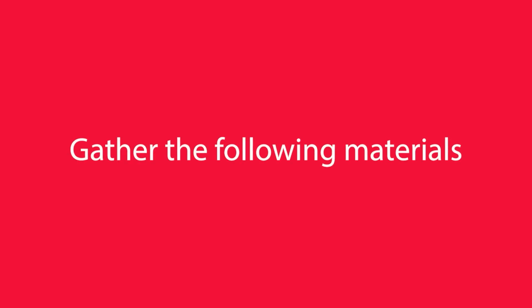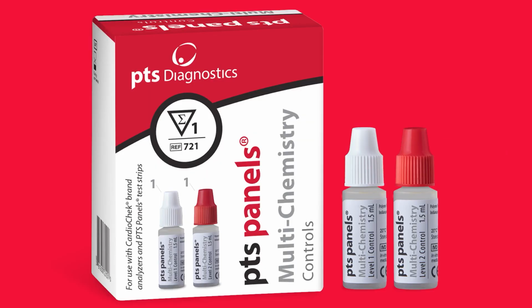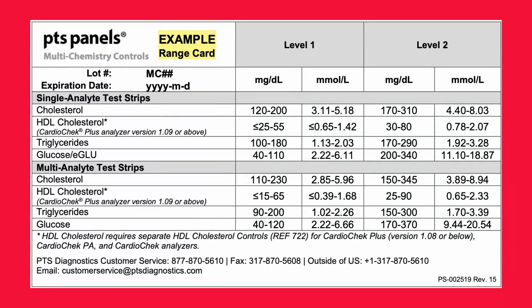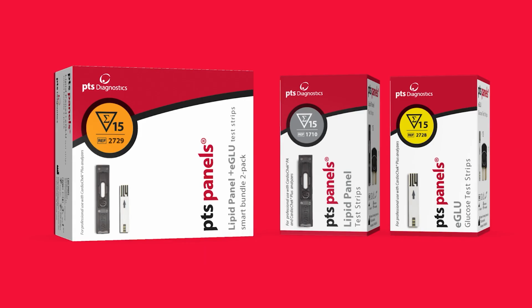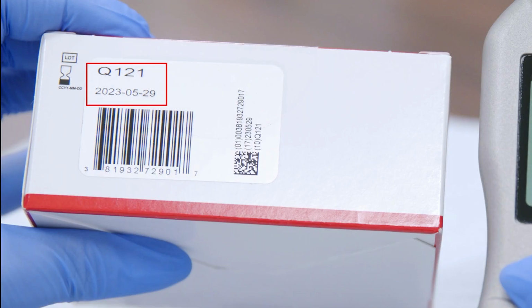Then gather the following materials: the CardioChek Plus analyzer, the Level 1 and Level 2 multi-chemistry liquid control materials, the quality control instructions, which can be found in the box with your control materials, the quality control range card, which can be found in the box with the control materials or at ptsdiagnostics.com, and the PTS Panels test strips and memo chip. Check the expiration dates on both the PTS Panels test strips and the control materials to make sure they have not expired.